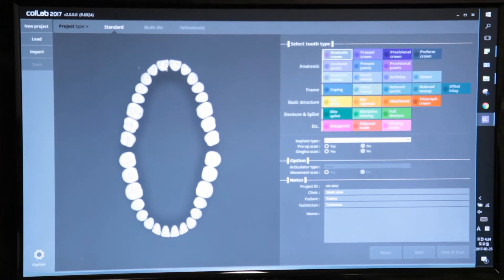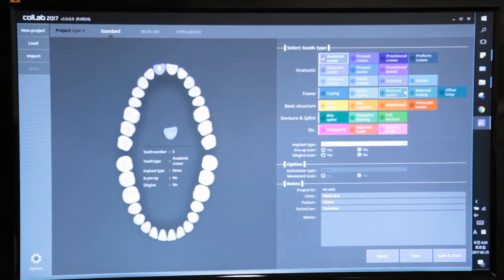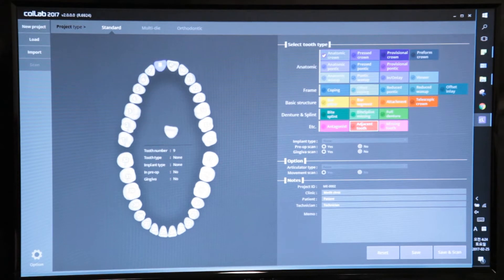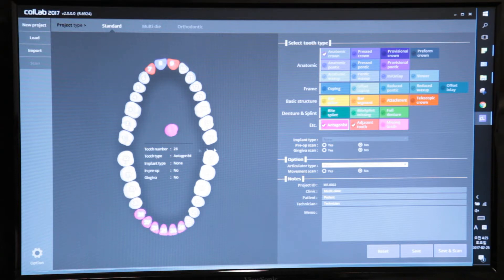Select the anatomic crown and then click on the tooth that you would like to scan for. We're going to tell the software that we're going to scan an adjacent tooth on number nine and number seven. Then we'll enter the antagonist teeth — start with 23 and hold the mouse button down all the way across to select all of the teeth we'd like to scan for.